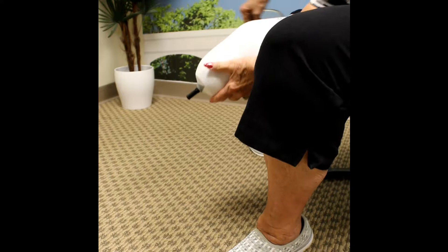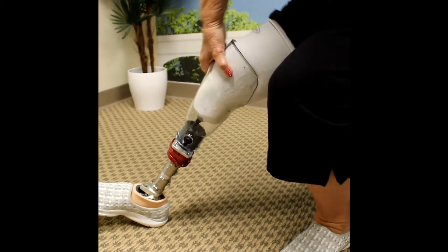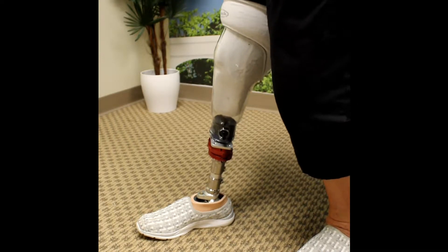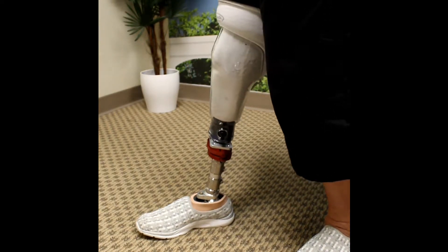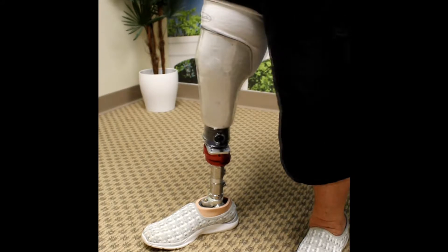How do you know how many socks to use? The prosthesis should be comfortably snug and you should be able to get all the clicks you normally do. Use the different sock thicknesses to achieve a perfect fit. If needed, you can place two socks on top of each other, such as a one ply and a three ply, if a five ply is too tight. If your socket begins to become uncomfortable after a few hours of use, it is a good idea to check and see if you need additional socks.